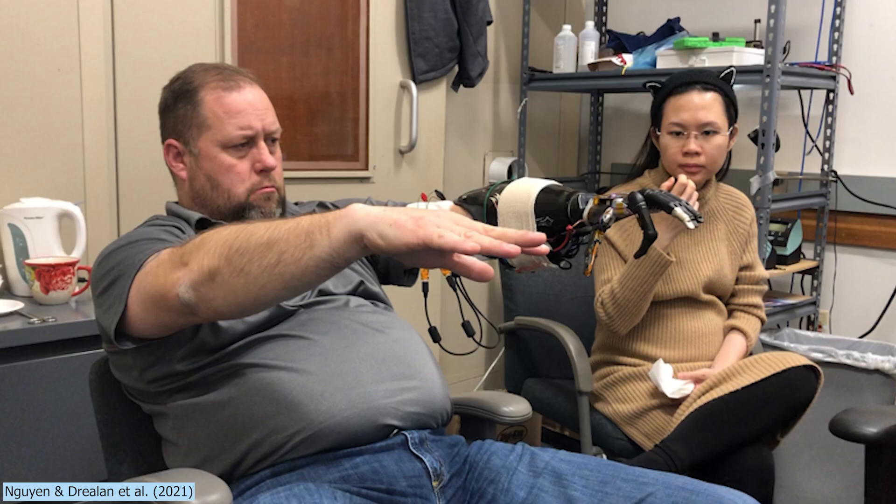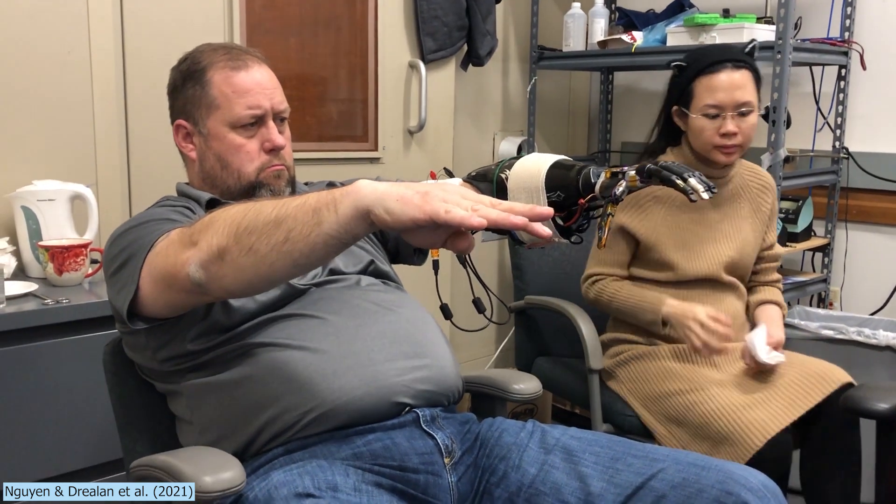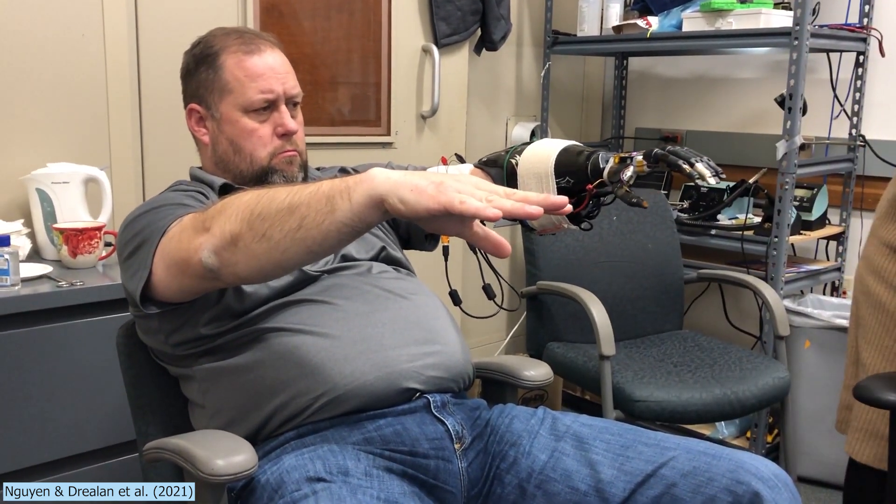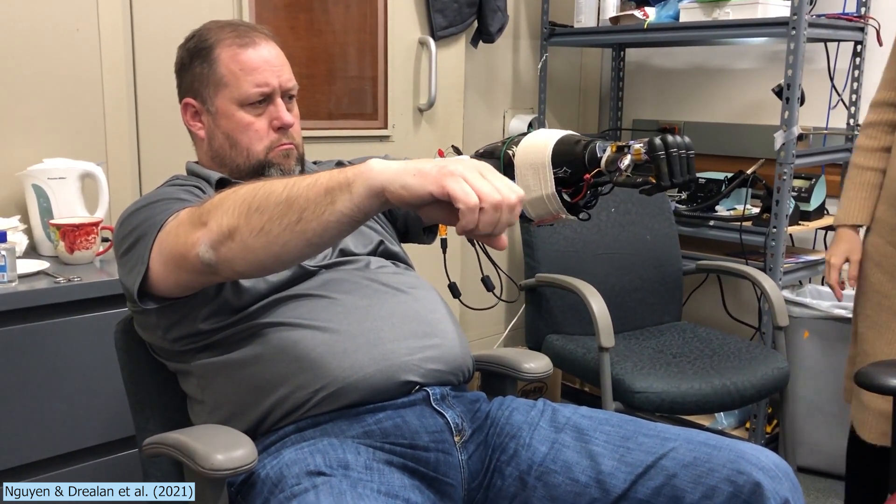This new paper applies deep learning to a neuroprosthetic hand to allow real-time control of individual finger movements, all done directly within the arm itself. With as little as 50 to 120 milliseconds of latency and up to 99% accuracy.